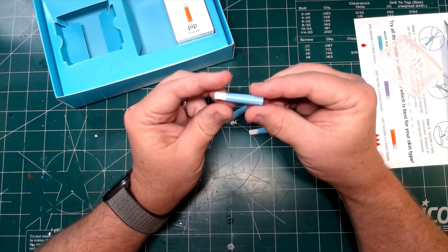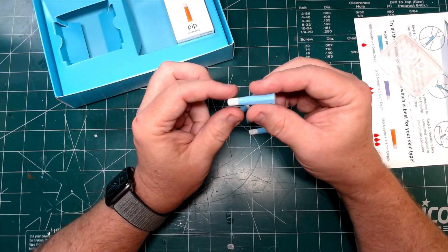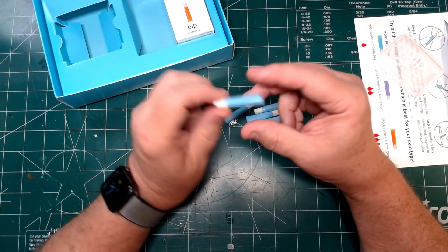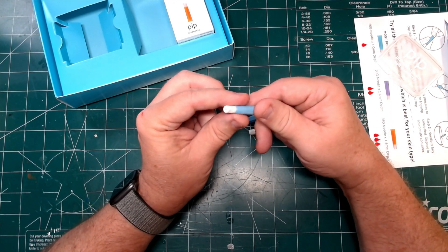Here is the PIP lancet, ready to go. No more big, giant injectors and having to set the needle up, put it in, cap it, and set the depth. This is just out of the box, ready to go.